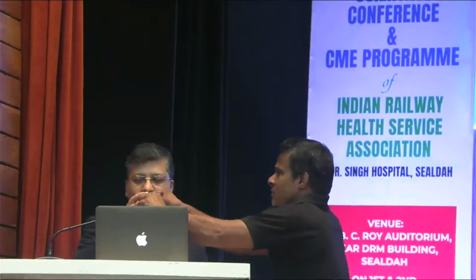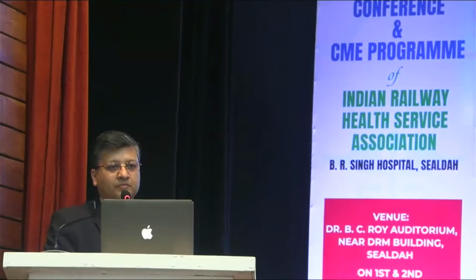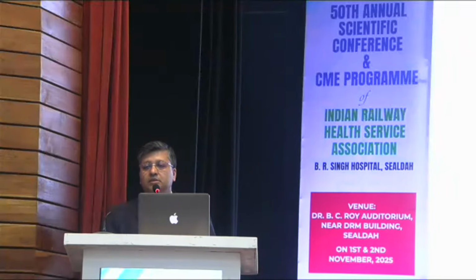With the subsequent research on dog ICDs, finally the first implant took place. Sudden cardiac death is complete cessation of the cardiac activity as well as the respiratory activity. And within a 1 hour period of time, if it is not intervened with proper measures, there will be biological death, and it is irreversible.